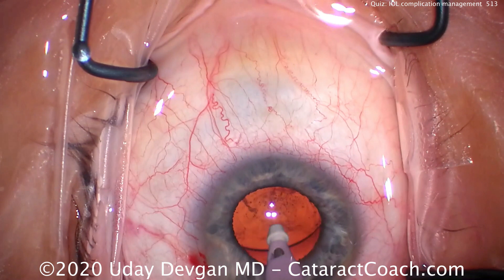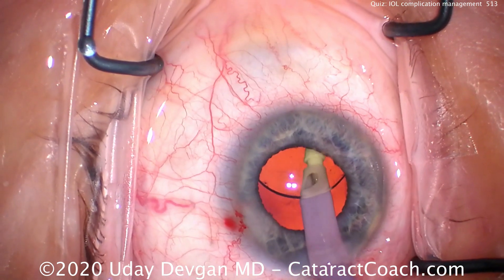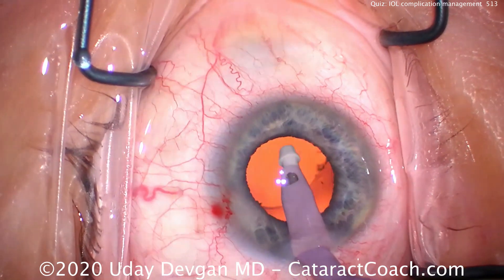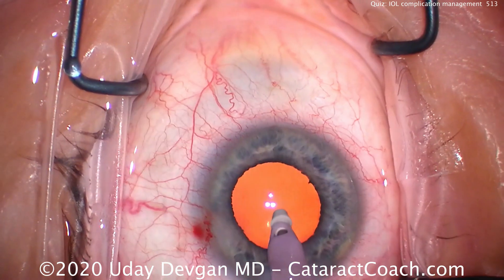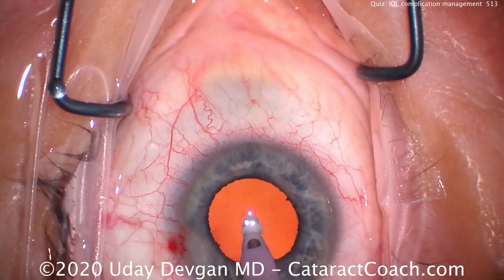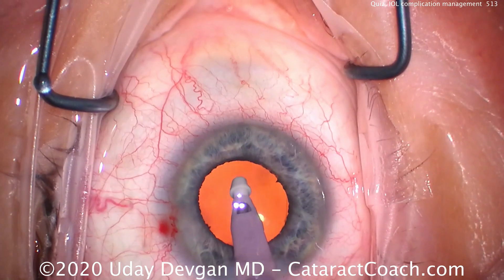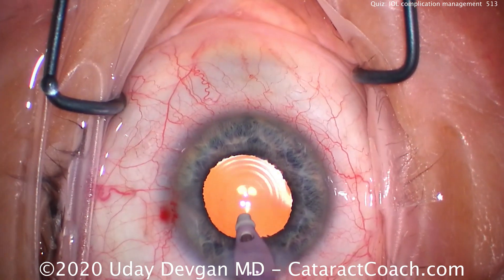The rest of the case will go smoothly and normally. It's important that you know how to load the lens into the injector, and even if you've already done it thousands of times, there are going to be rare cases like this where the lens may not go in just perfectly and you may have to make an adjustment. In this situation, we could tell before we ever put the injector tip inside the eye — we saw that trailing haptic had unfolded and it was going to be caught in the cartridge and up against the plunger.